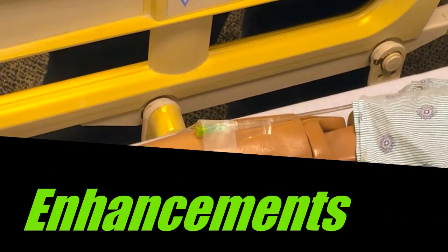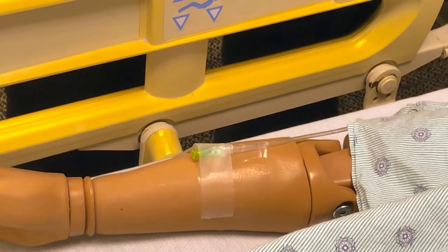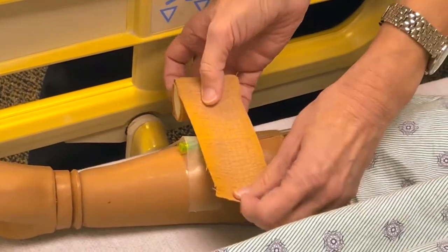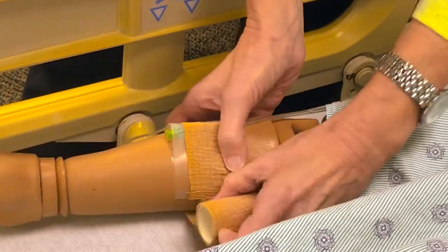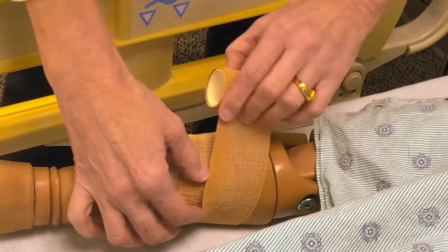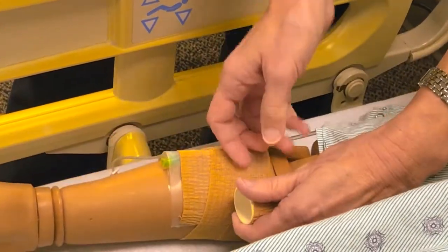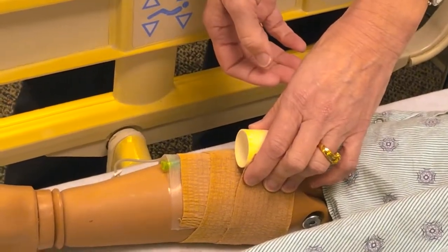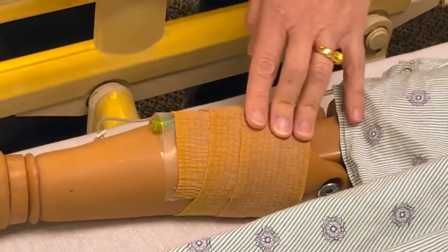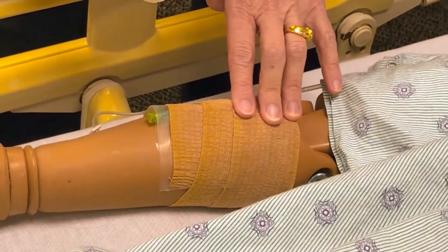One possible enhancement of the simulated IV bypass system would be to use this compression dressing or an ACE wrap to conceal the drainage tubing and secure it to the mannequin's arm. You could also consider using a compression sleeve that is in the same color as the mannequin skin tone.